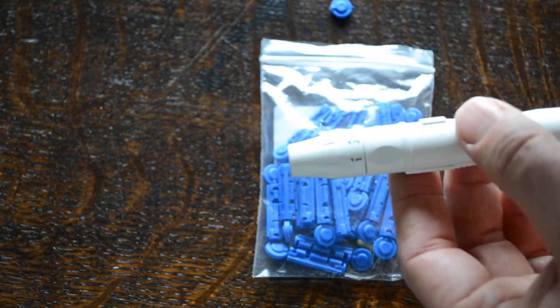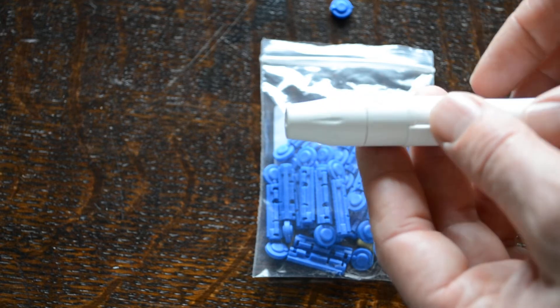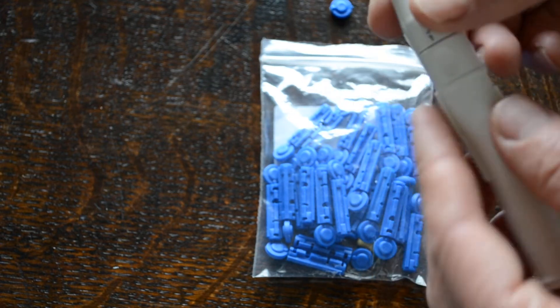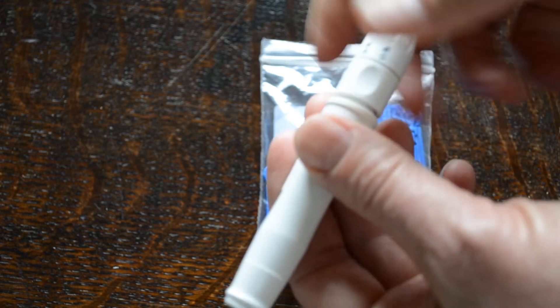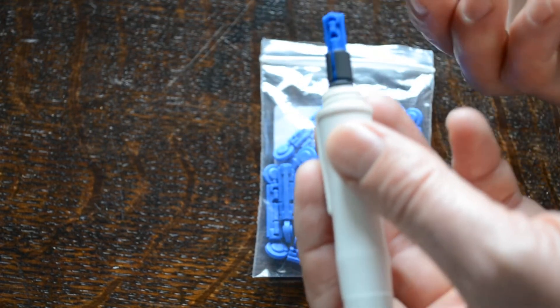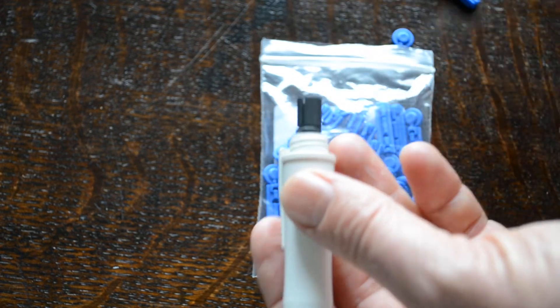The idea of the meter system is you have the test strip applied into the meter ready to go, then auto-lance and apply the blood straight onto the meter test. To remove the lancet you can just remove that one.